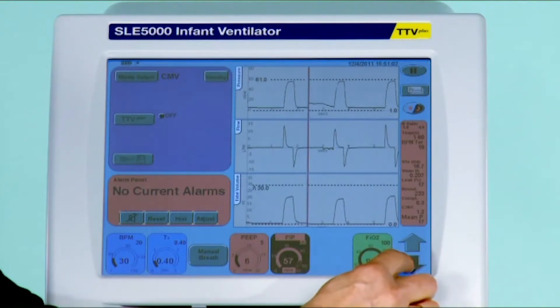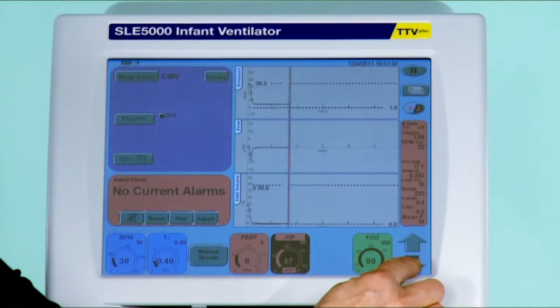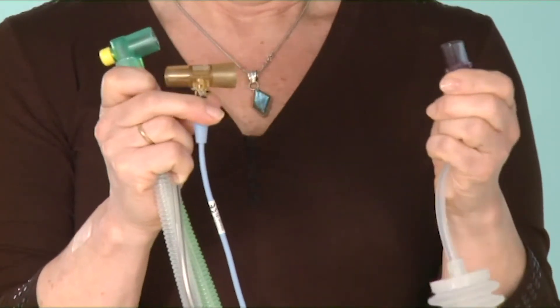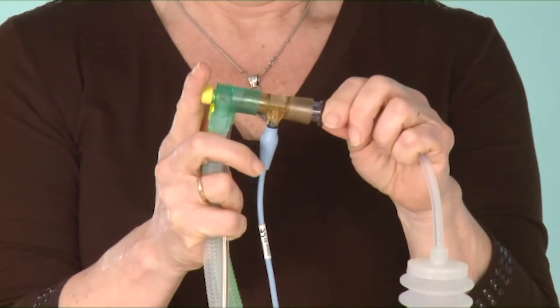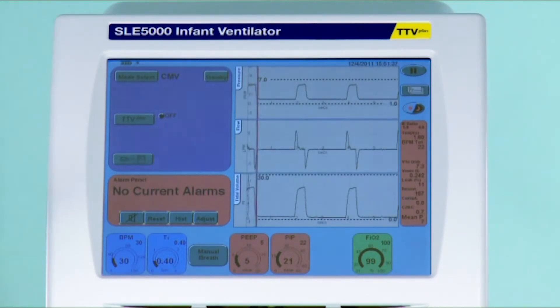I'll reset these two pressures to a more reasonable level and show you this once again. To disconnect and reconnect the flow sensor: disconnect the patient circuit first and then the patient. Once ready to reconnect, first reconnect the patient and then the patient circuit. By doing this, you should not have to recalibrate the flow sensor unless it has been disconnected and reconnected in the wrong way, or there is a real issue with the flow sensor, for example clogged with secretions.